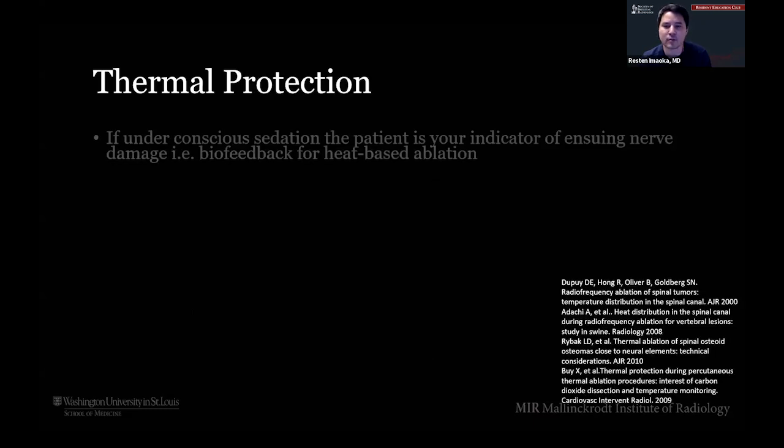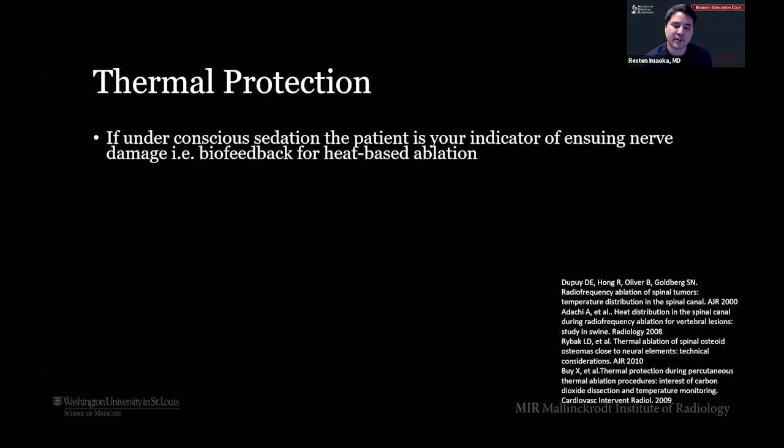So when we talk about thermal protection, specifically in the spine, and we're talking about RFA, we like to talk about conscious sedation and the patient's biofeedback being the best thing to let you know, right? They're going to let you know if you're pissing off a nerve, whether they get some radicular symptoms wrapping around their chest, or their abdomen, wherever you are. They're going to let you know for sure.